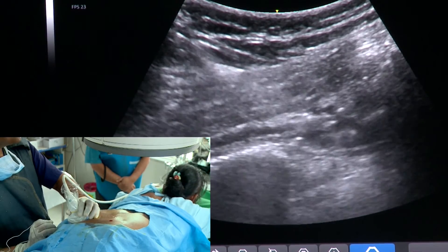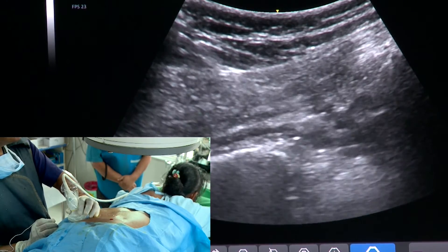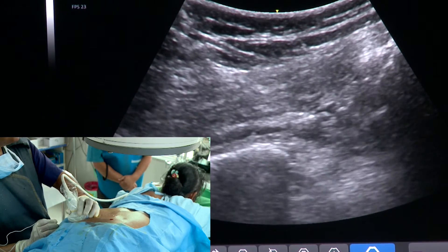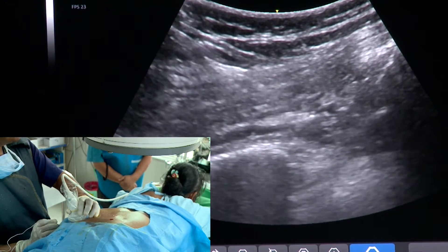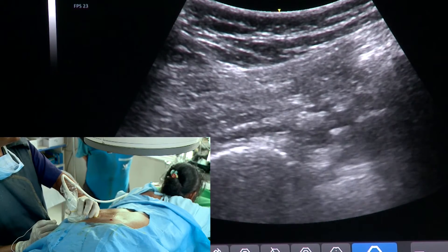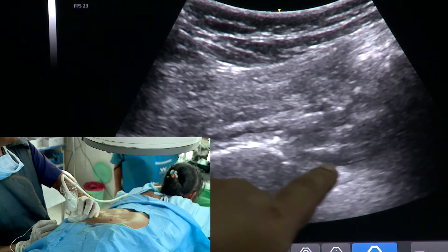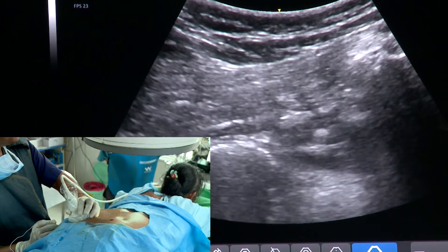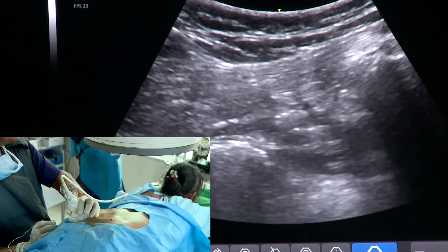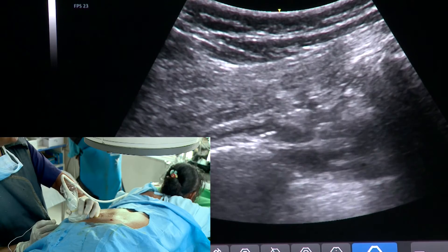Now what I will do is puncture it through and through, and then I will be injecting dextrose towards the sciatic nerve. I am injecting dextrose there — this is the sub-sciatic plane. I am giving around 10cc of dextrose there. You can see the other structures are being pushed down.